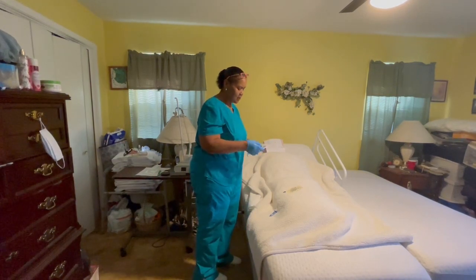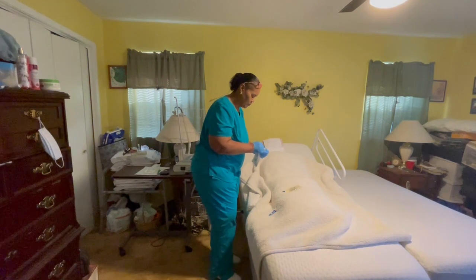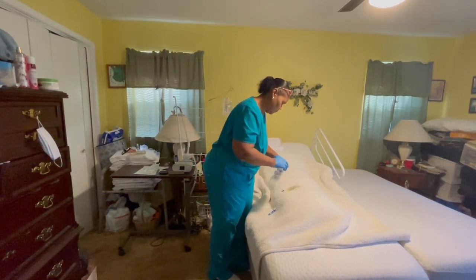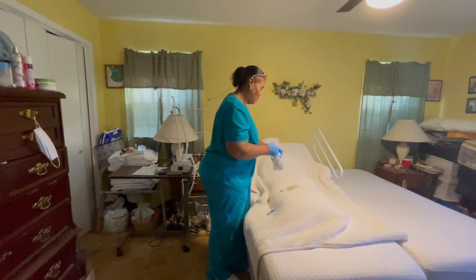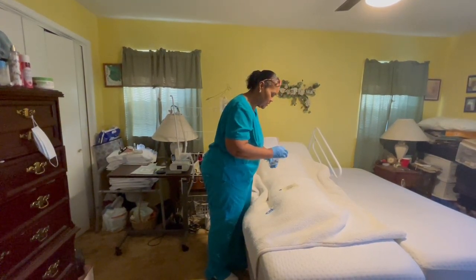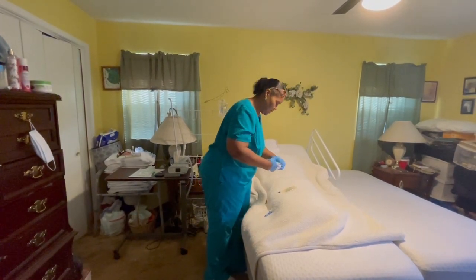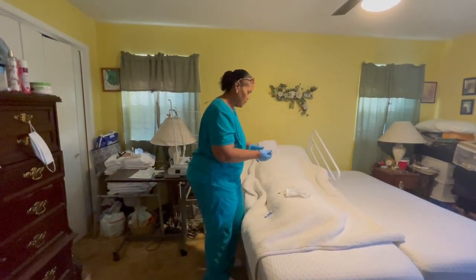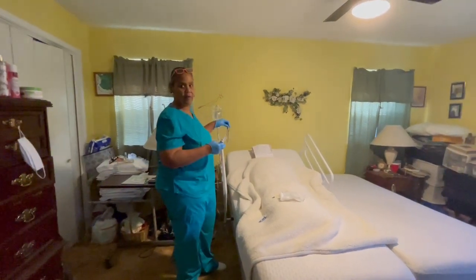Now, on my secondary tubing, there's going to be a little blue hanger in here. And that's going to be for the gravity for my primary, because my patient already has D5.5 running at 100 mils already. So this is what we're going to be using to bring the primary down for gravity purposes.